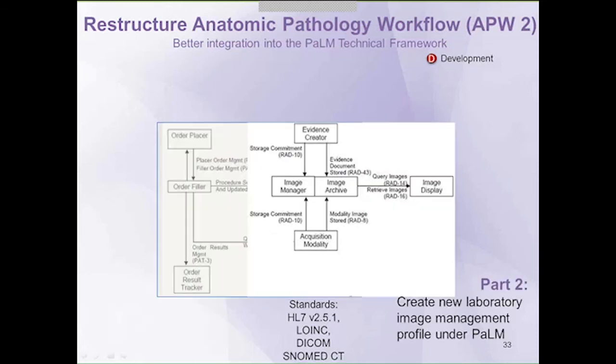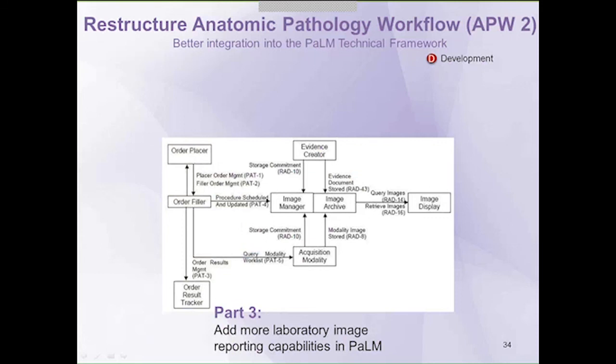So if we go to the next slide there. We see that on the radiology domain, there's significant work already in terms of their management of digital images with an image manager, archiver, some mechanism of acquiring those images, and then, of course, displaying it for interpretation by the end user. And so if we go to the next slide, you see the combination of all of them put together. So this is being proposed, and the PaLM group is working with DICOM to help better define what is the future digital imaging workflow for pathology and laboratory medicine.